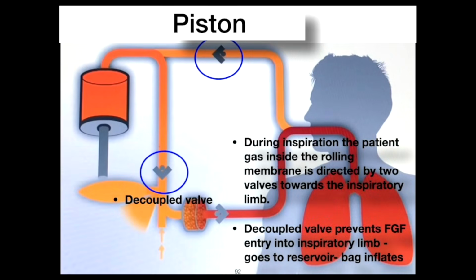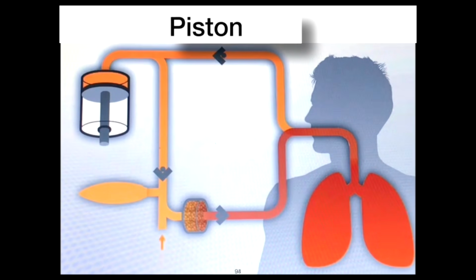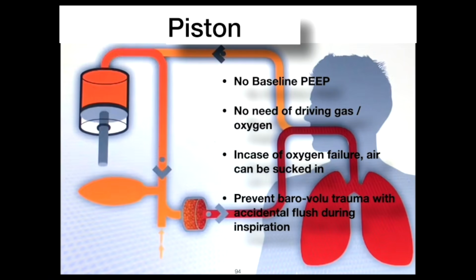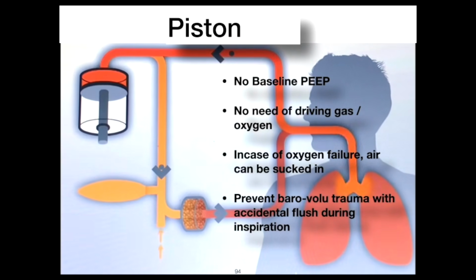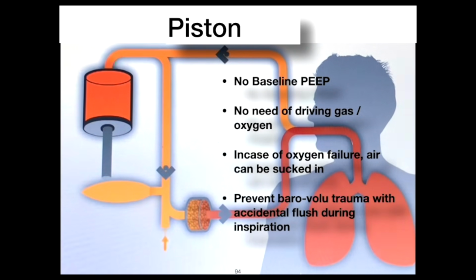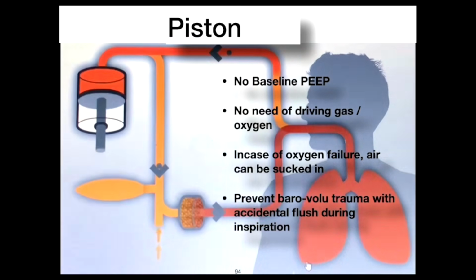There is a decoupled valve, which you already understood, and the behavior we already understood with the piston machine. So there is no baseline PEEP. You will not find any type of PEEP in a piston machine. No need for driving gas or oxygen, so of course it is better. And in case of oxygen failure, if there is no oxygen, there is a mechanism where it will open up the valve and air can be sucked in.